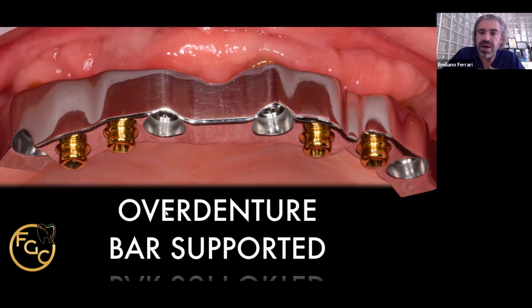Okay. There's a kind of bar that you can screw on those attachments, and this bar is called OT bar. The characteristic of this bar is that it's very easy to construct and gives you more passivity with respect to all the other kinds of bar that you can do.